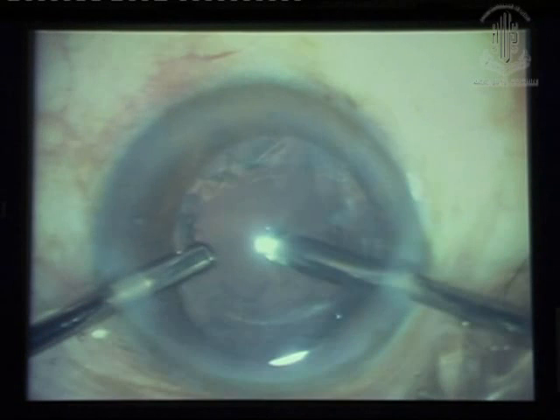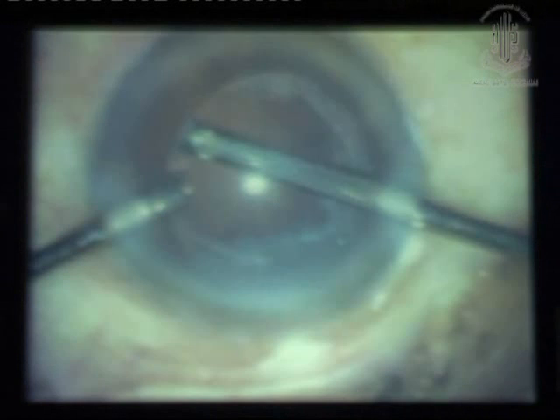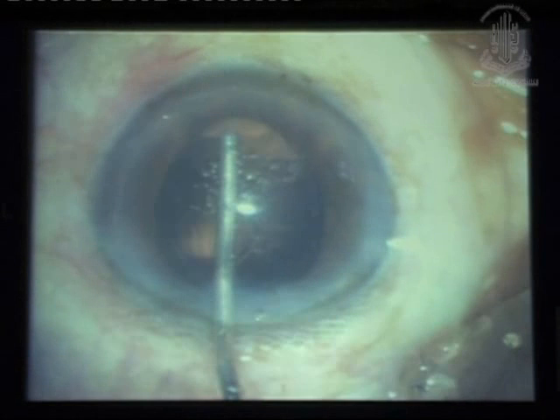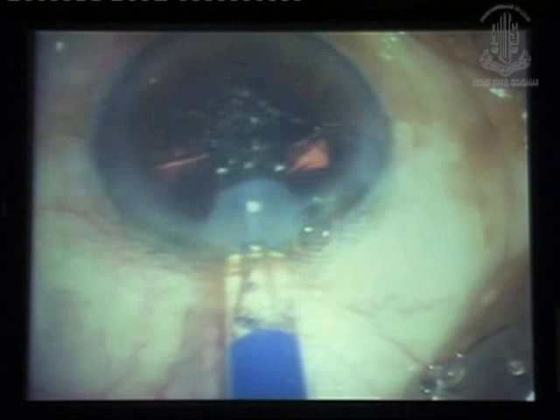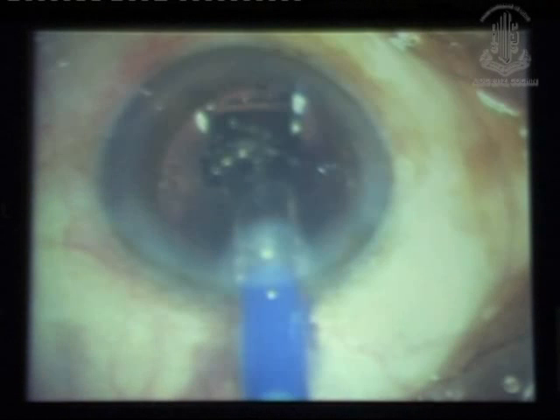Okay, so there I removed the cortex. In fact, I removed most of the posterior capsule during my vitrectomy deliberately. Now I am creating space in the sulcus, just like I did for the multi-piece IOL. And this is a single piece hydrophobic IOL going to the sulcus.